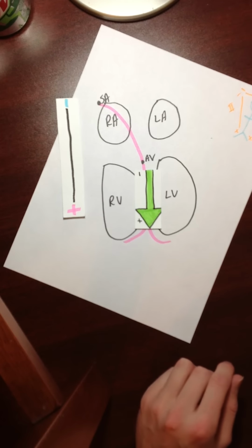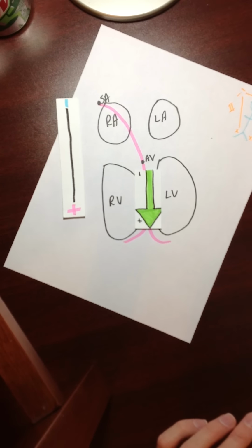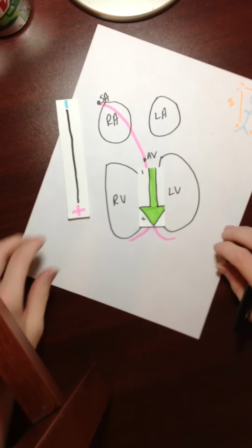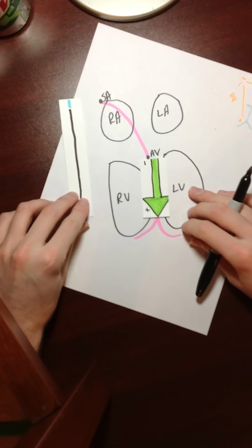If you look at an ECG, I had one around here, I can't find it, you'll notice that lead 2 is often very, very large because this lines up. If it's not, that means some other lead is more aligned with it. Hopefully this makes sense. This goes through here, repolarization, it's still all positive.